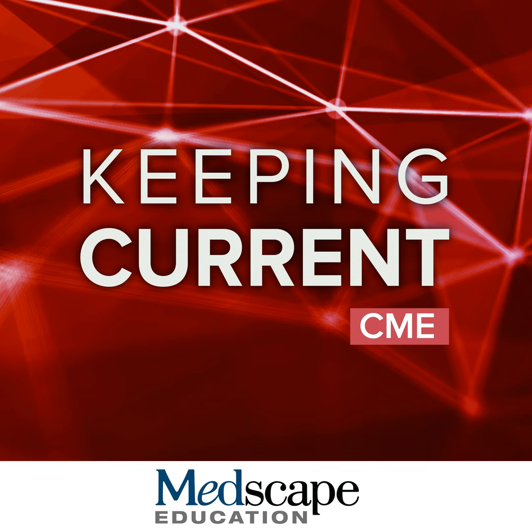All right. So how do we explain this to patients, because they're asking a lot about which test should I get and how should I approach this? So first of all, if a patient has Alzheimer's disease, they should have a positive amyloid test, and that's going to be true for plasma, spinal fluid, and brain PET scan.